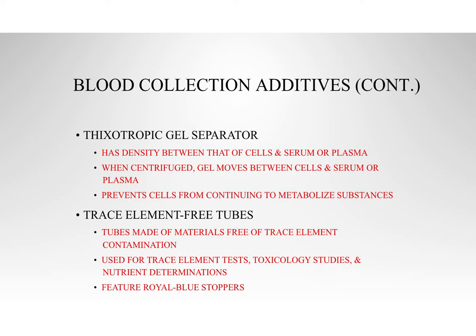So basically, these trace element free tubes are tubes that are made of specific material that has no elements that we may be testing for in the tube.